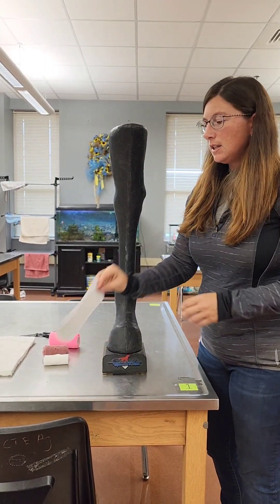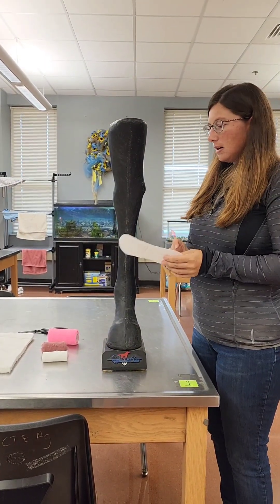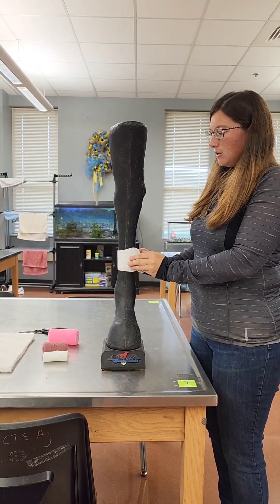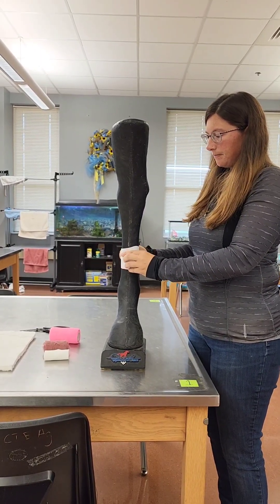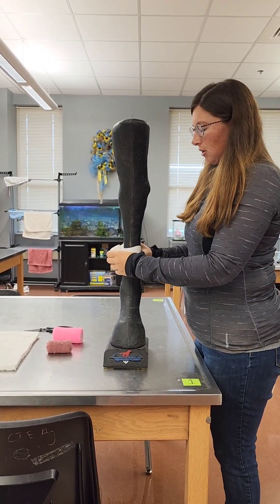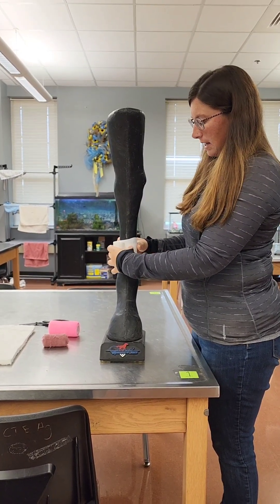The first thing you're going to do is take your dressing or sterile gauze and wrap it around the wound. Then you're going to use your roll gauze to secure your bandage.